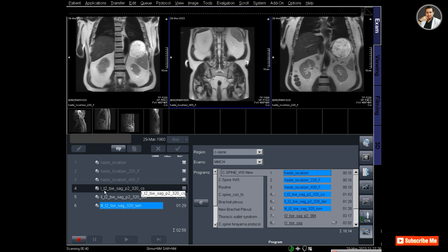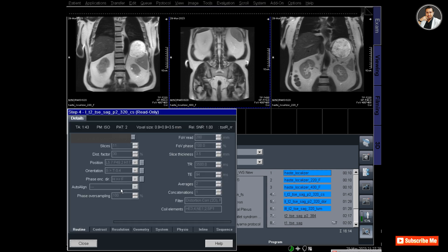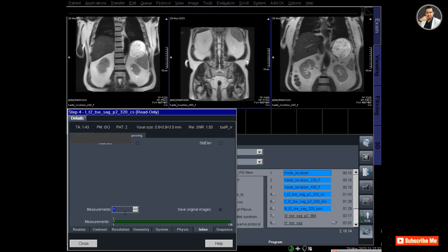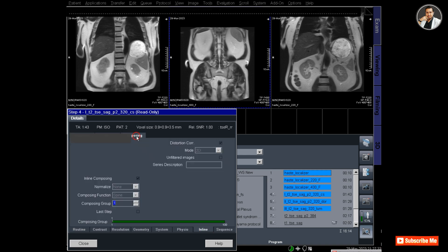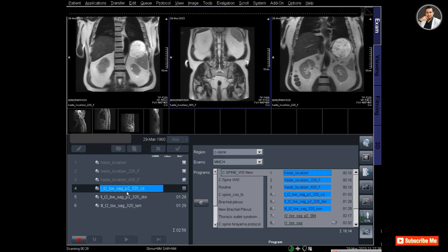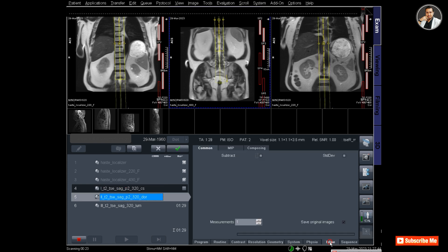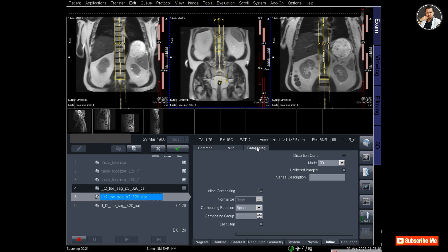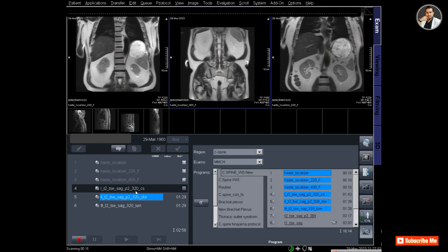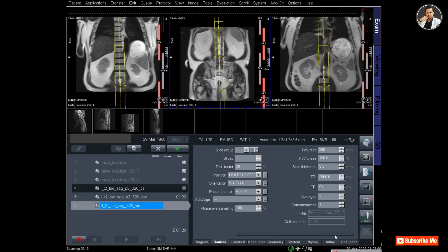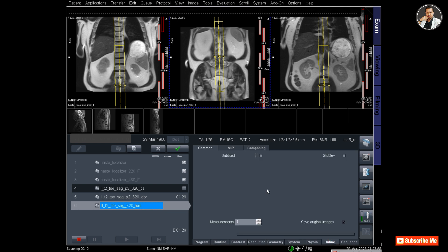They will scan one after another. You'll see there's a function called composing - it should be tick-marked in all the protocols. Go to system, then go to inline. The composing and inline composing should be tick-marked.